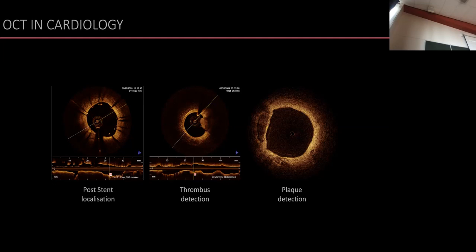And then this is the surrounding tissue of the artery. And you can see some layering in there. I'm not sure if that's really visible for you guys. Which is all these muscular layers of the artery and some endothelial cells. That's how the lumen is built up.